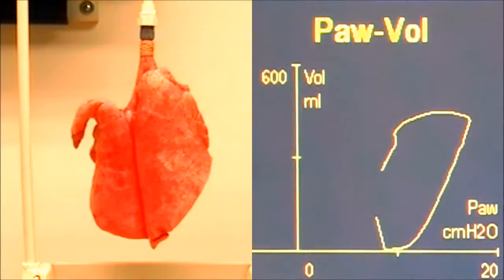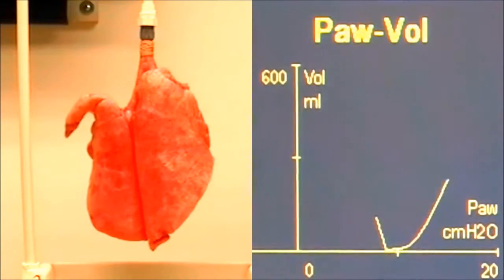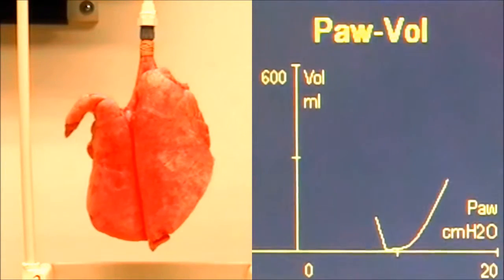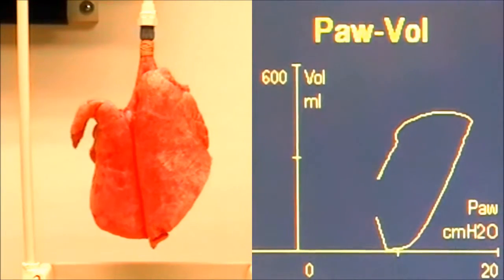If you look, I went to 8 of PEEP, but after the recruitment breath, my lungs look a lot better. And again, I may even need more PEEP to keep my lungs fully recruited.